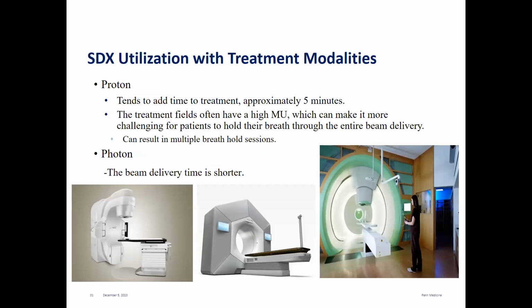So here at Penn, we have proton and photon machines. We do utilize SDX for both of those modalities. For protons, it does tend to add a little extra treatment time to the patient's table time. The treatment fields often have a high MU, which can make it more challenging for the patient to hold their breath through the entire beam delivery. So this results in you having to break up the beam into several different multiple breath hold sessions.